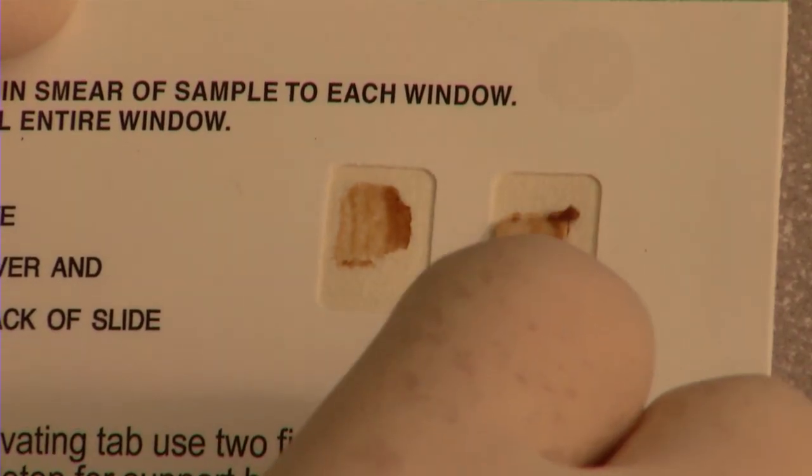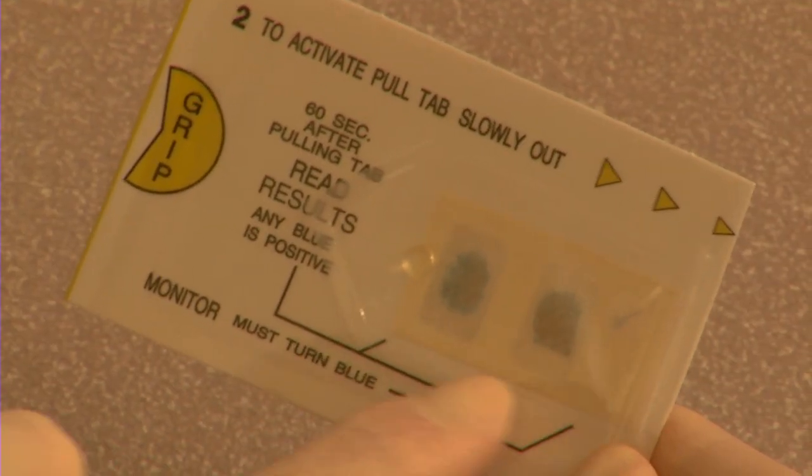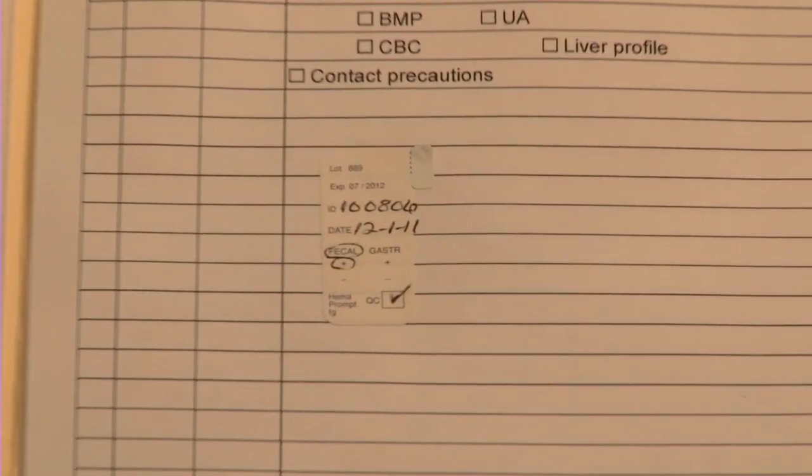HemaPrompt FG is fast. Once the specimen is applied, results are ready in one minute. And there's a removable label on each test card for result charting, making it easy to get required test information on patient charts.